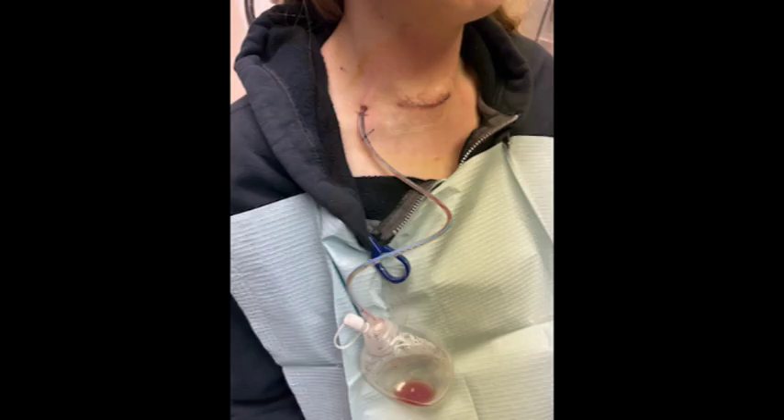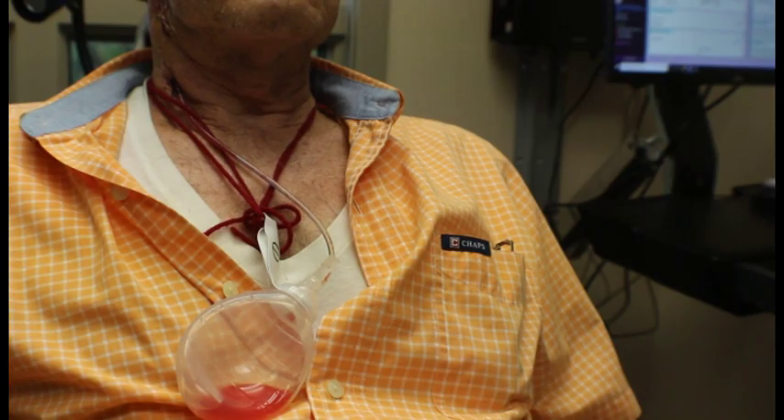Here you can see a drain a few days after surgery. You can see there's some drainage in the bulb. The bulb is charged and clipped onto the clothing so that it's not hanging by the tubing and pulling on the patient's skin. You can see this patient has supported the bulb with a necklace he made out of yarn.